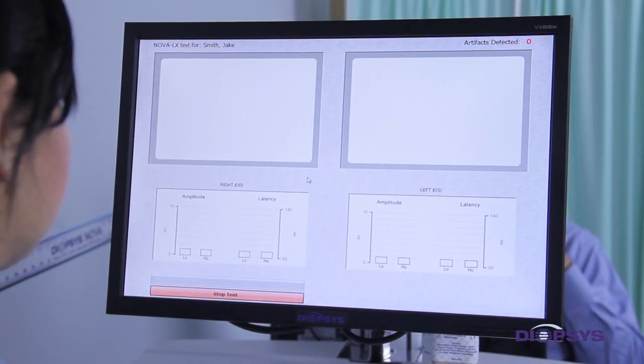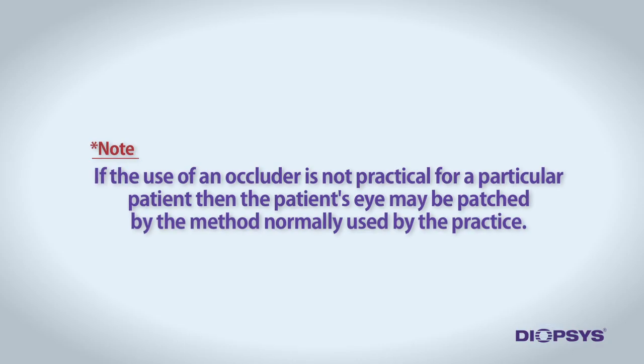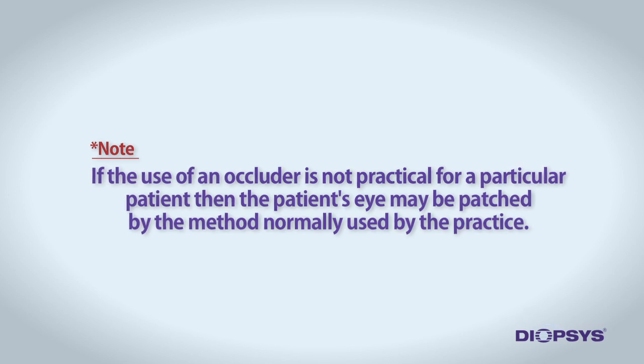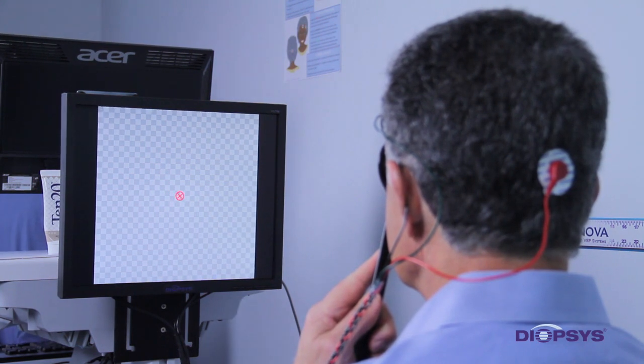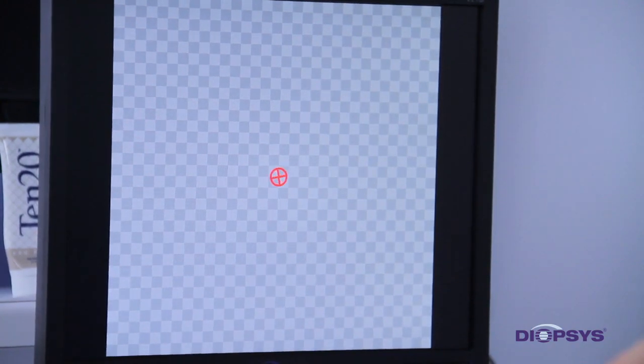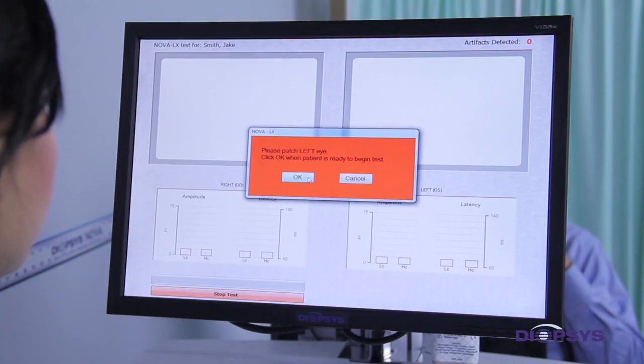The first prompt will instruct you to patch the patient's left eye. The easiest way to do this is to have the patient use an occluder to cover the left eye. If the use of an occluder is not practical for a particular patient, then the patient's eye may be patched by the method normally used by the practice. Once the patient's left eye is covered, let the patient know there will be a red circle surrounded by black and white squares. Instruct them to look towards the red circle while keeping the squares in focus and to blink naturally. Both eyes should remain open. Select OK.